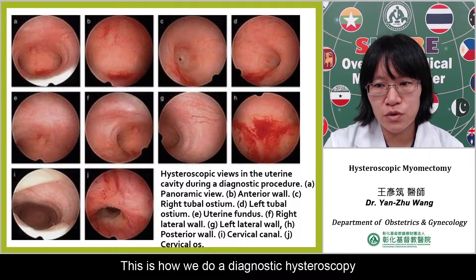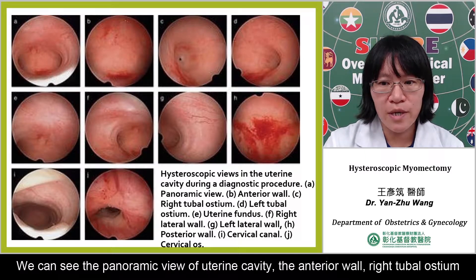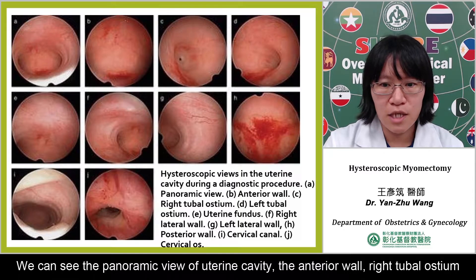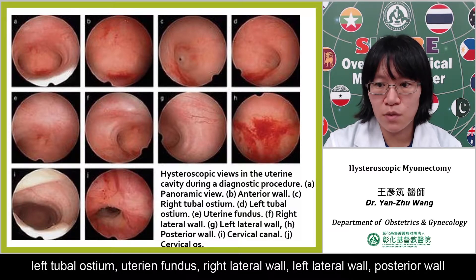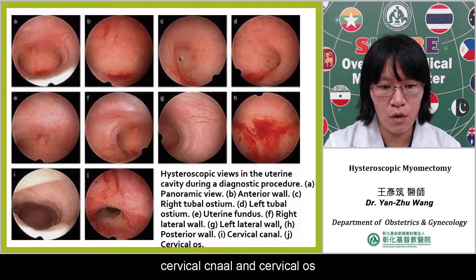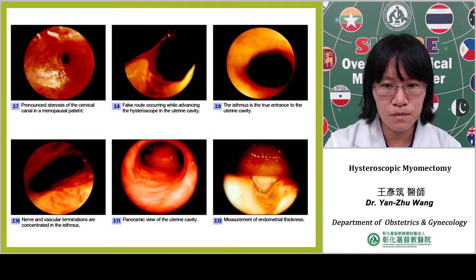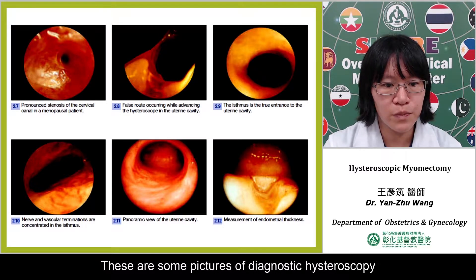This is how we do a diagnostic hysteroscopy. We can see the panoramic view of uterine cavity: the anterior wall, right tubal ostium, left tubal ostium, uterine fundus, right lateral wall, left lateral wall, posterior wall, cervical canal, and cervical os.